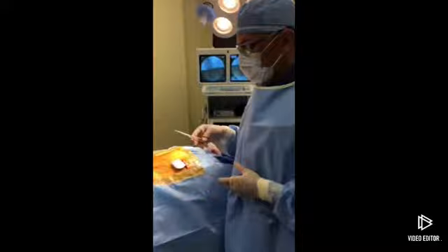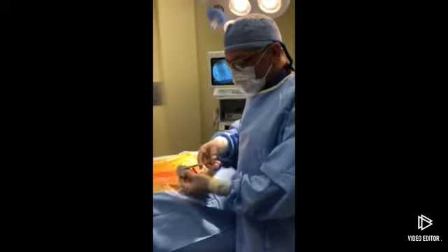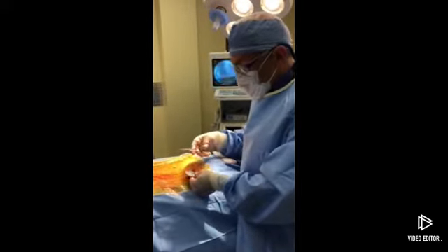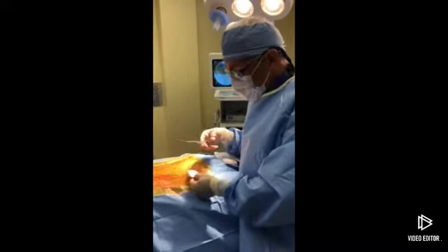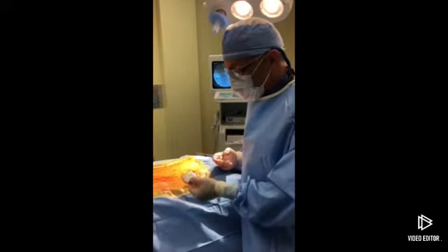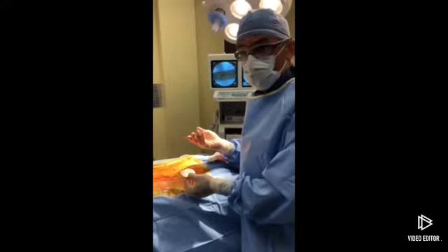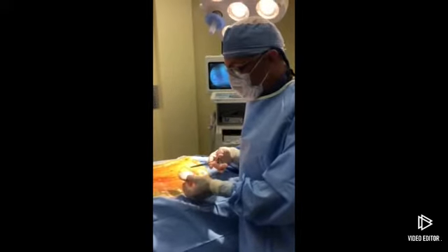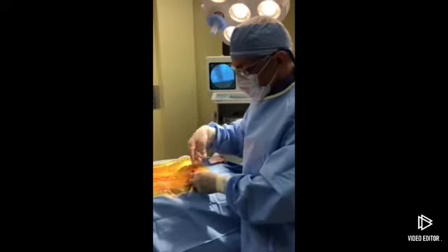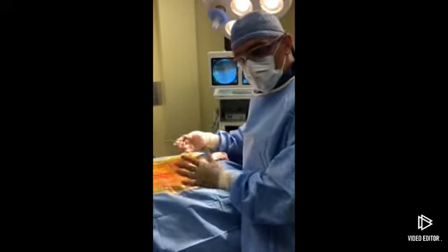Okay, so what we've done now is we've attached the lead, tunneled it underneath the skin, and attached it to this implanted programmable impulse generator. We've implanted the generator and we've tested it. Even when this is implanted under the patient, you can see how small this is. Isn't this small? This is fantastic. Look at how tiny these batteries are. This will go for 3, 4, 5, 6 years, maybe even more. Try 8 or 9 years with these new batteries, and they're pencil thin. So basically, we'll implant this in here, we'll irrigate everything out. The patient will be left with 2 small incisions, and that's basically the end of this treatment.